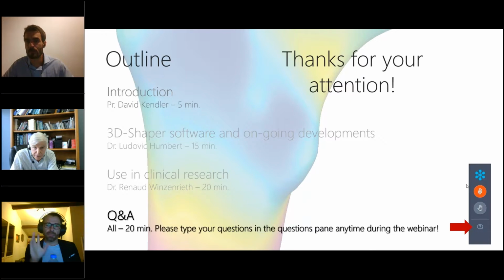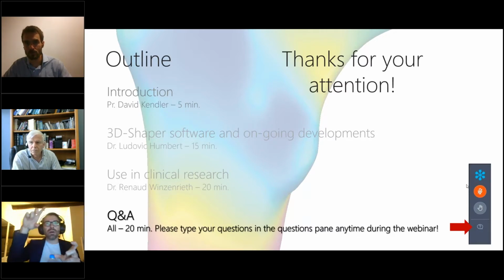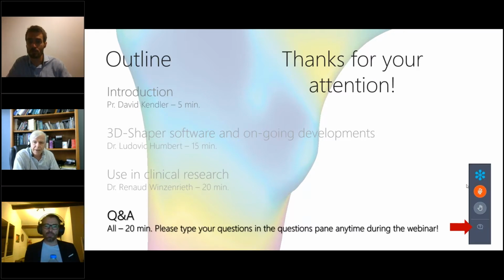Yeah, so we're just at the top of the hour, Renaud. Yeah, go ahead. Just to say that in terms of pediatric application, the only thing that we could think is to use the approach considering children at the end of the growth, when you have almost the entire femur, the final shape and density distribution. So I would say after 16, it's still children now. You could imagine using our approach, the 3D modeling, to check, but it's research. I don't know if it works well or not, especially for the density distribution, because the density still continues to increase. Yeah, that would be very interesting in elucidating the developmental aspects of the skeleton in pediatric patients.